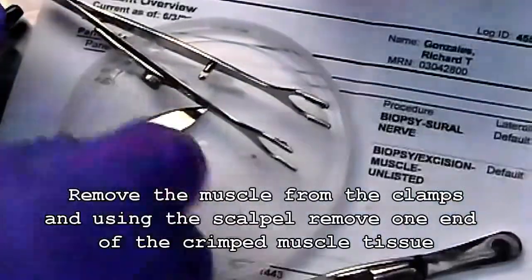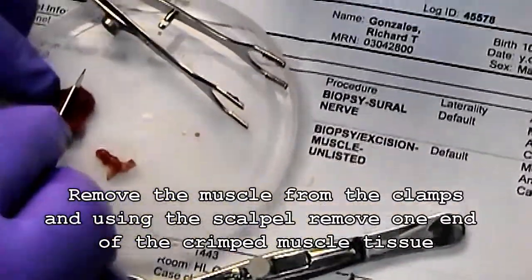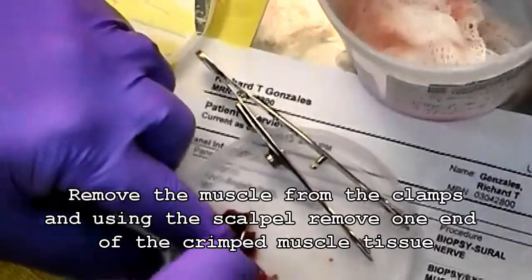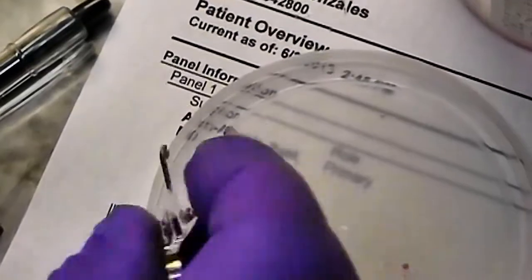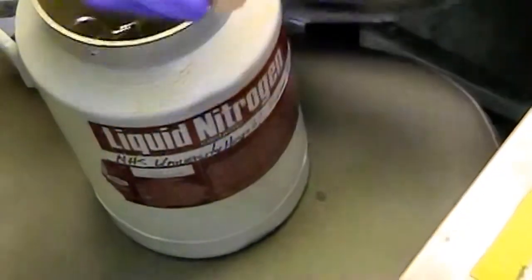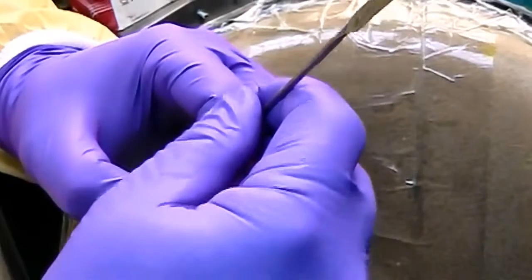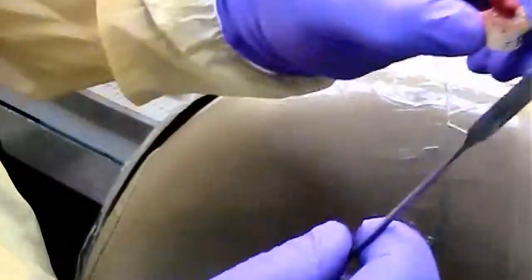Got a lot of fat on it. We don't want the fat. And we don't want the marks that the clamp made, so I cut that part off. And where I cut, that's actually going to go up in the... So clamp marks down in the gum, where you cut up. So you only cut one side then? Right. Something like that.